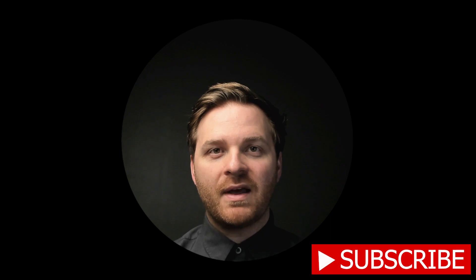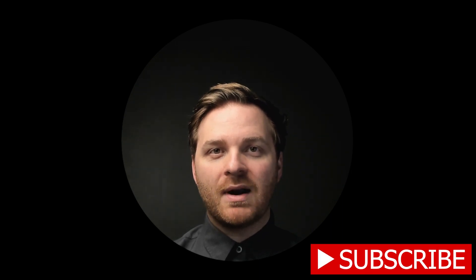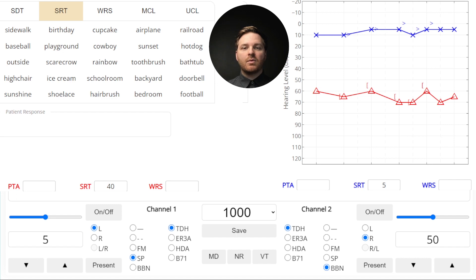Someone recently requested a video demo on speech masking, so I've decided to record this video with a demonstration of SRT and WRS masking. I've got a case pulled up in Theta that will require speech masking. We've got normal hearing in the left ear with a moderately severe hearing loss in the right.